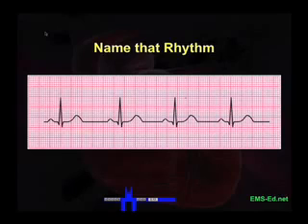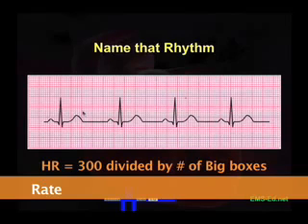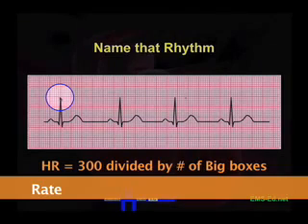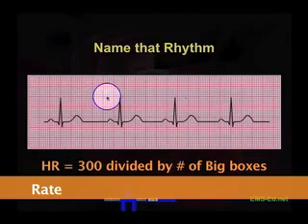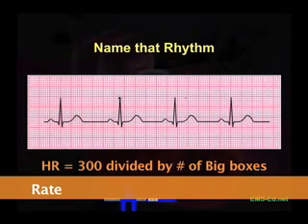This strip looks just like the last one, except it looks slower — the complexes are farther apart. Let's figure the rate. We'll find an R wave that's close to a dark line. Counting: one big box, two, three, four, five. Five into 300 is 60, but this is slower than 60 — that would be 50. So the rate is between 50 and 60; let's call it a heart rate of about 54.